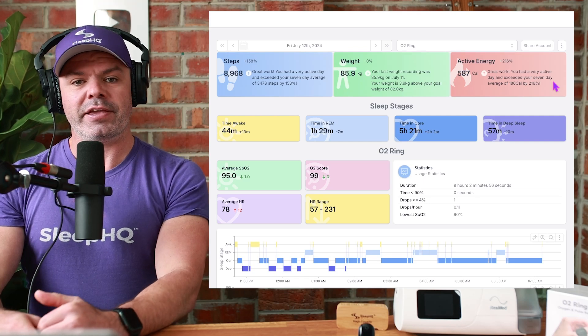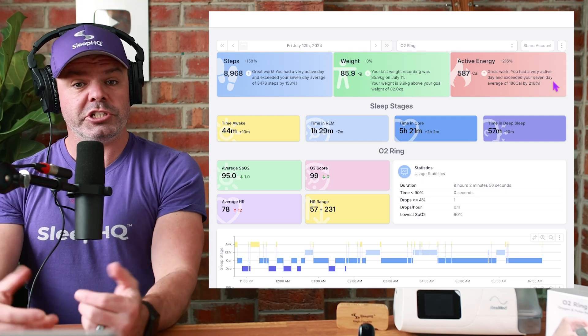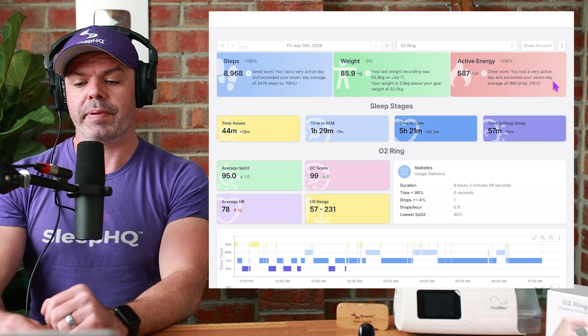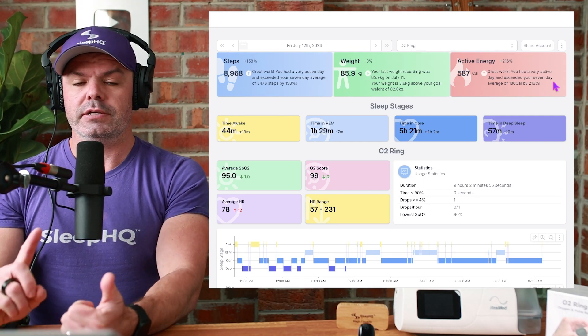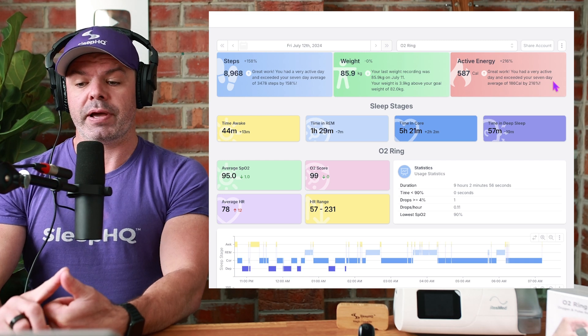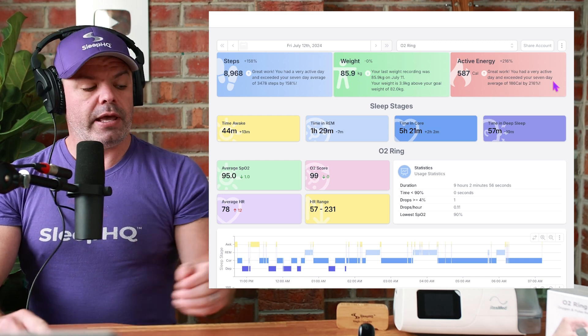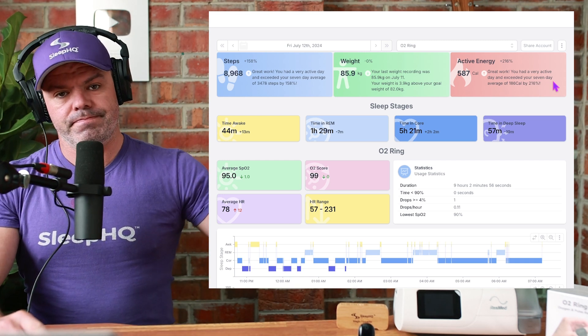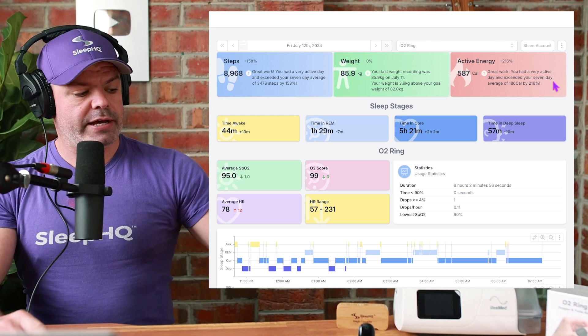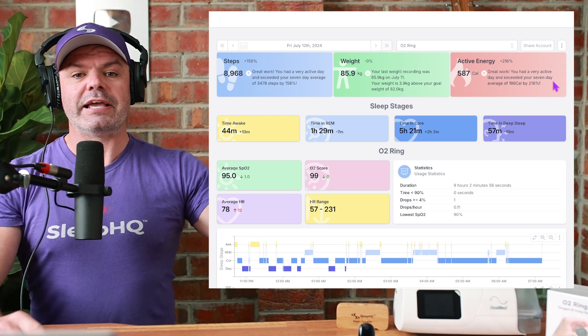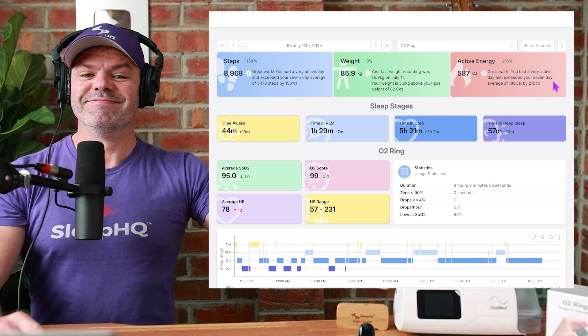Now to finish up, I'll show you how you can create your very own share links for free using SleepHQ. Step one, sign up for a free SleepHQ account and you can upload your data. Or should I say data?